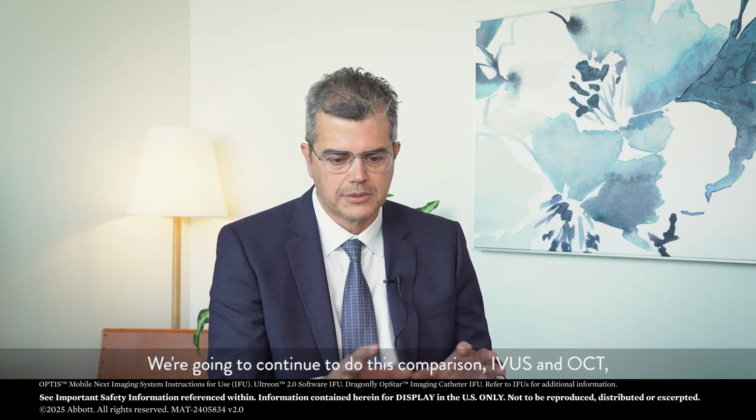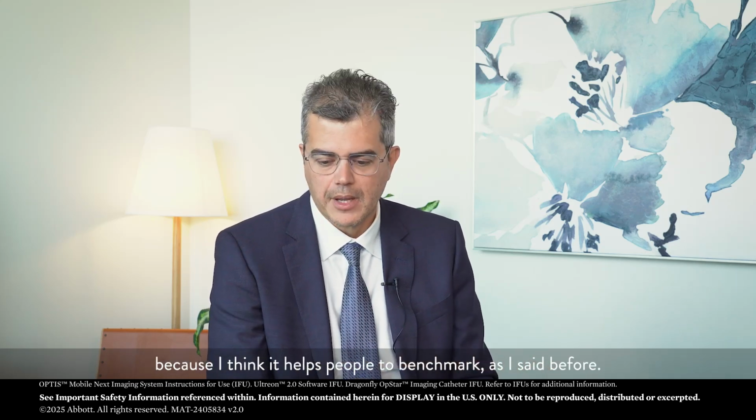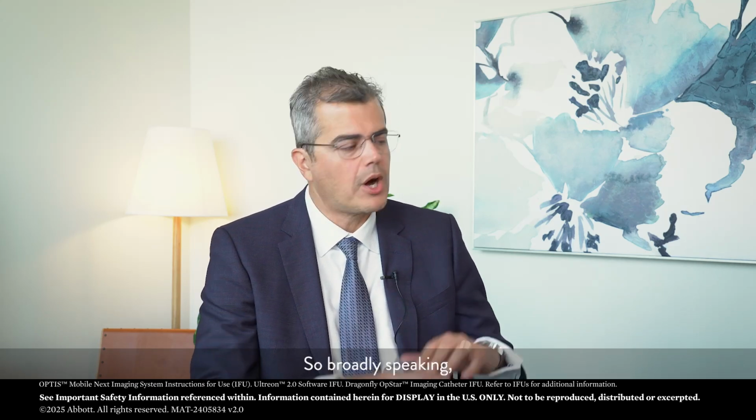Awesome question, and again, very relevant. We're going to continue to do this comparison, IVUS and OCT, because I think it helps people to benchmark, as I said before. Broadly speaking, because the predominant tissue in coronary artery disease is fibrotic tissue, IVUS has more tissue penetration in fibrotic tissue than OCT.